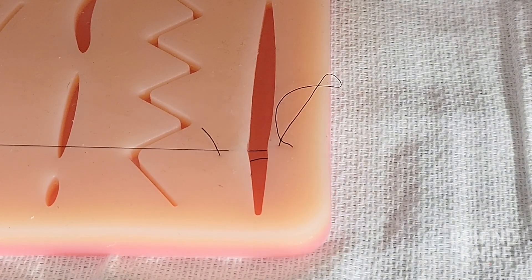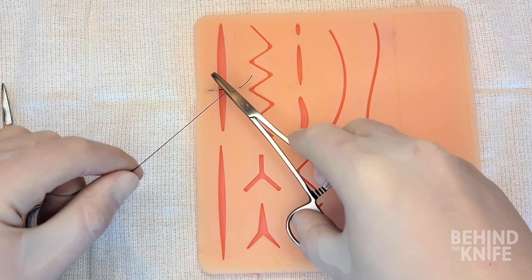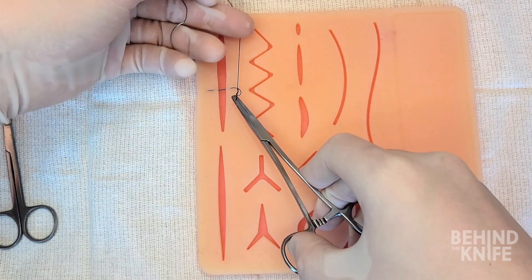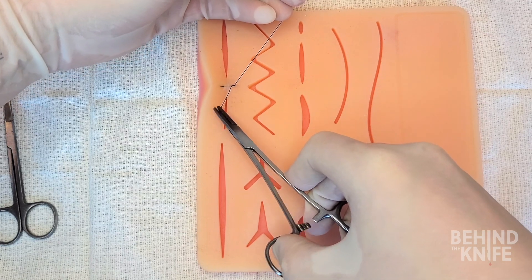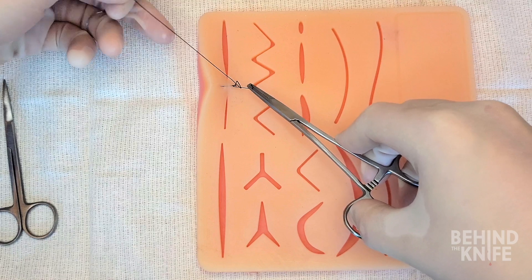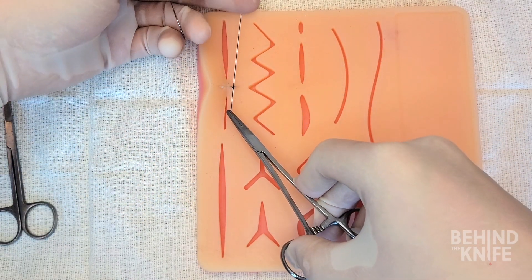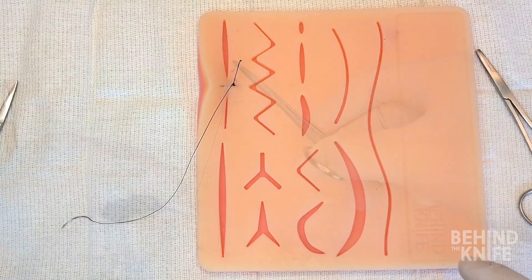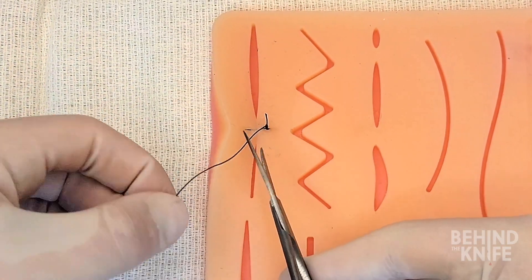At this point both ends of the suture thread should be on one side of the wound. We'll now instrument tie these ends so the knot is on the side where the suture initially started. When tying this knot, the suture should be tied down snug but not excessively tight, as the tighter the knot is, the more eversion of the skin edges, which will produce a more extensive scar. Once you've cut the suture, you've completed a vertical mattress suture.